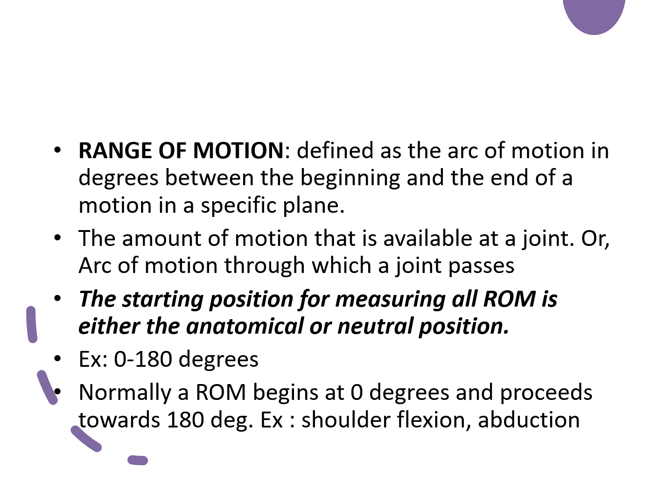So when I say that shoulder abduction is 180 degrees, you know how to do shoulder abduction. Your palm is hanging next to your trunk. From that position you start and you take your arm away from your body, in the frontal plane.